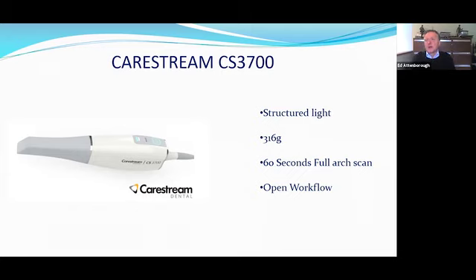Carestream has its own environment as well called CS, and that includes CBCT and milling and various other different options, so CAD/CAM options. So a well-proven technology, third generation, and quite popular, well integrated with other items on the market.